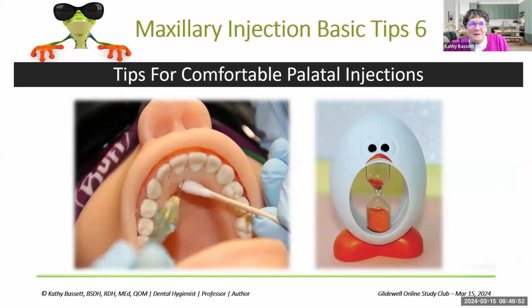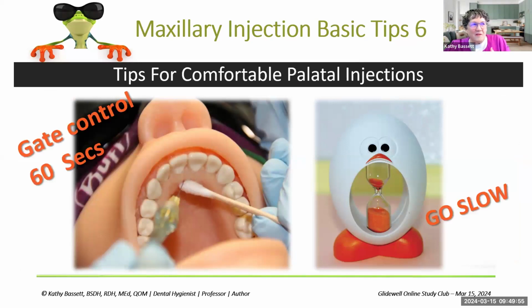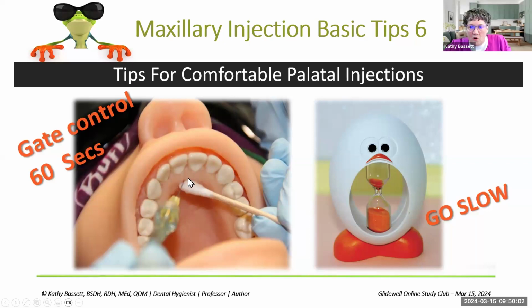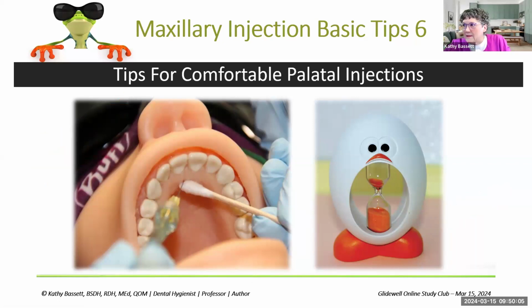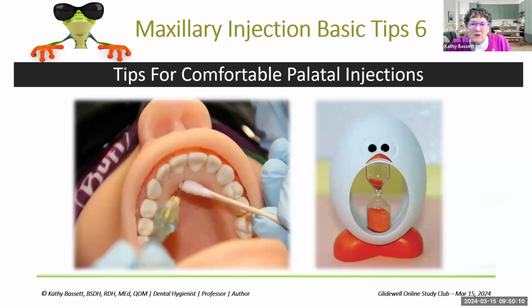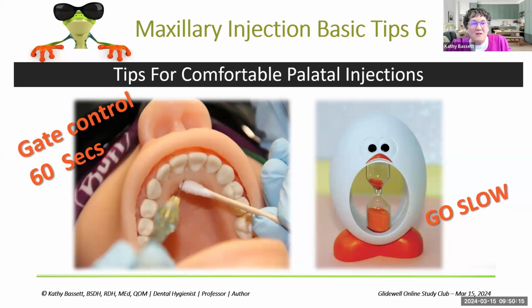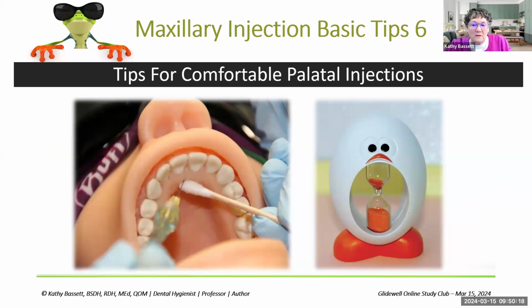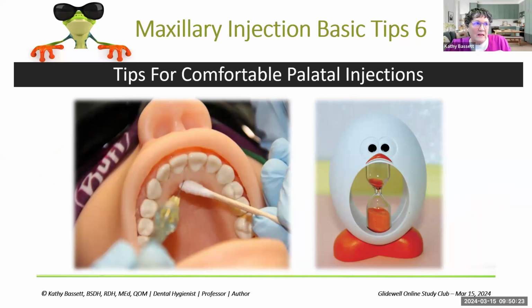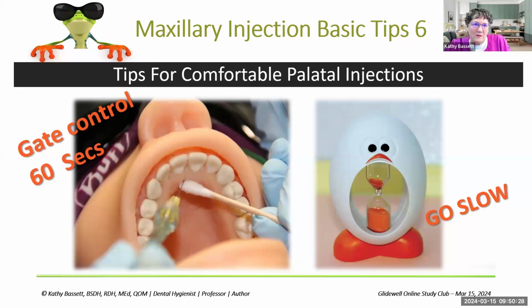Anytime we're giving any palatal injections, and I just can't say this enough, and the number of times I've really watched the opposite happen, just please slow down. One of the things when you're using pressure before, it takes the body 50 seconds to realize that it has another signal coming. So gate control response doesn't kick in for about 50 seconds. So you need to use a full minute and then go slow, because the injection hydraulics in this area, the pressure coming to that needle, can really cause trauma to those tissues. And that's what the patients are responding to.